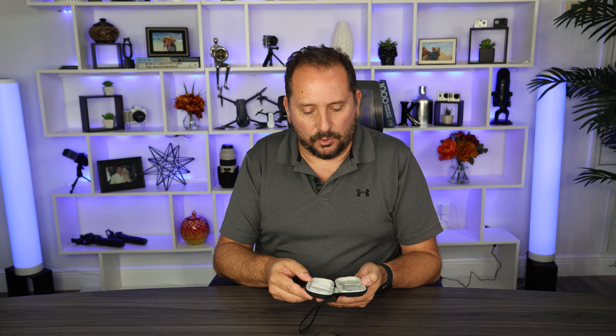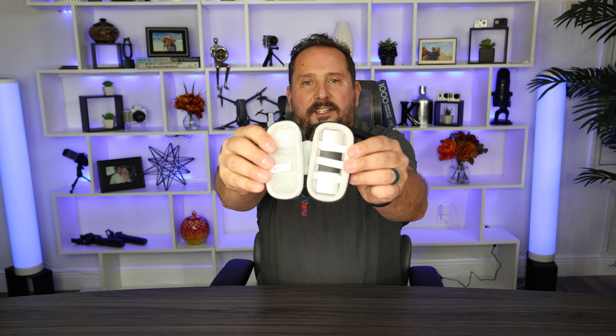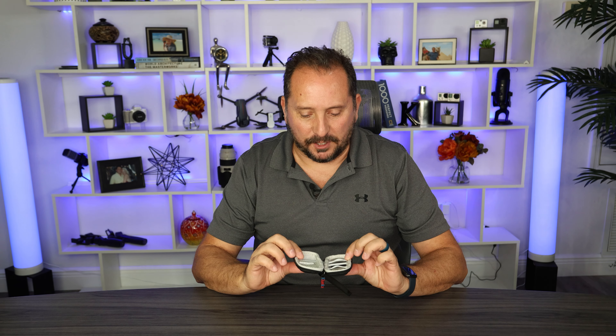Let's open it up. Inside of it is a perfect compartment. Let's make sure it fits right. Yeah, exactly made for it. Fits perfectly.